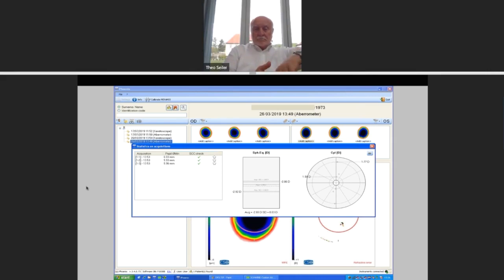We just choose the scan with the largest wavefront diameter, based on some previous work we've done that shows that the larger the wavefront acquisition diameter is, the more accurate your treatment tends to be. But there are other strategies. You can simply pick the median of the 3 scans in terms of the spherical equivalent refraction, find something that works for you, and stick with that in terms of scan selection.